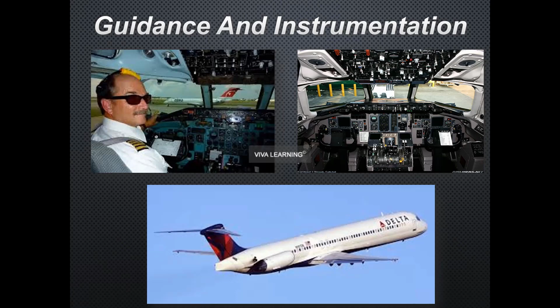And that's kind of like what we're doing in our implant arena. It's prosthetically driven implant placement, where you're placing your implants according to where they need to be placed with the final crown or the final full arch restoration. That really negates and stops a lot of trouble versus just going in and placing the implants and then trying to restore those later.